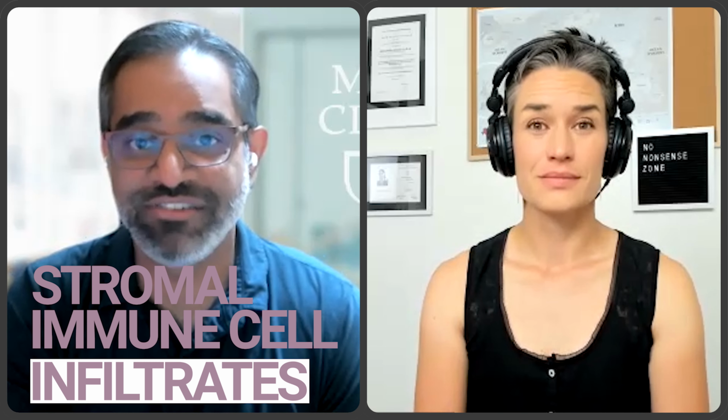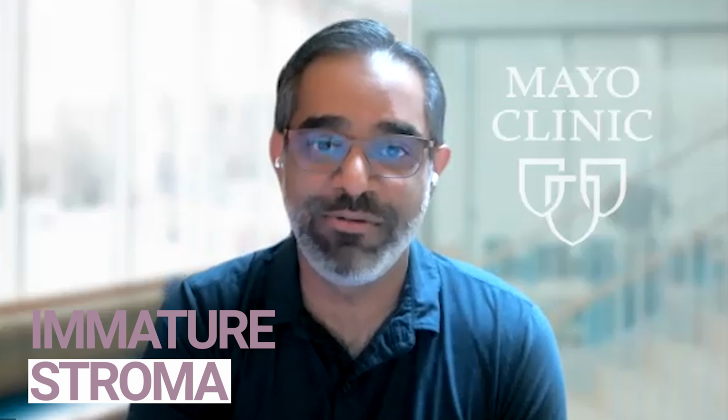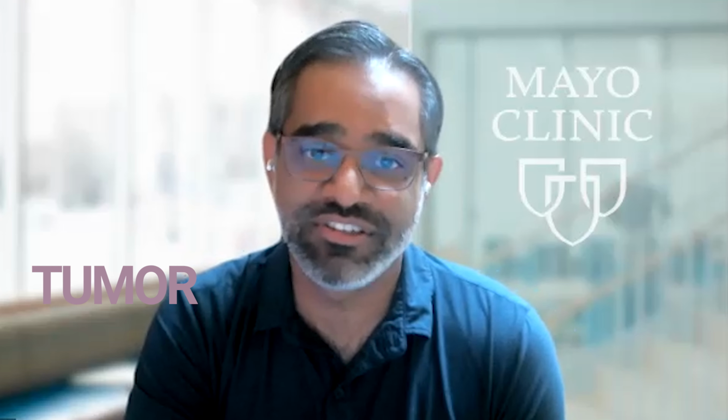And then within the stroma, there's some interesting data that the different types of stroma have different meanings. If the stroma is rich in infiltrative immune cells, that portends probably a better prognosis than if it's immature stroma. So I wanted to identify that. And the last thing was tumor-infiltrating lymphocytes, these lymphocytes that are infiltrating the tumor epithelial cells.